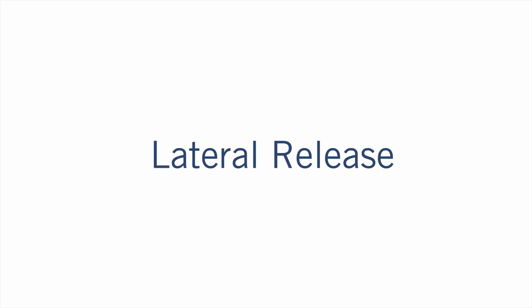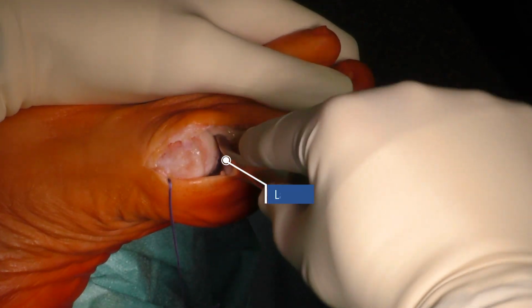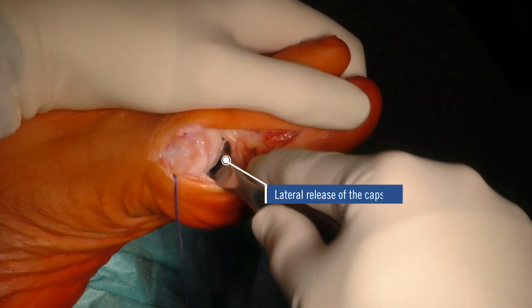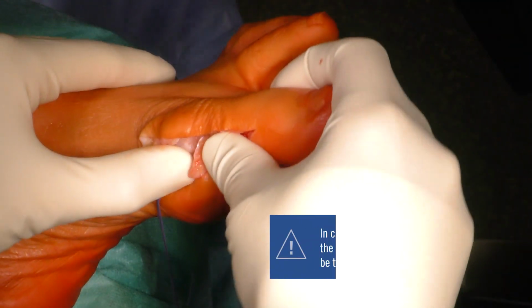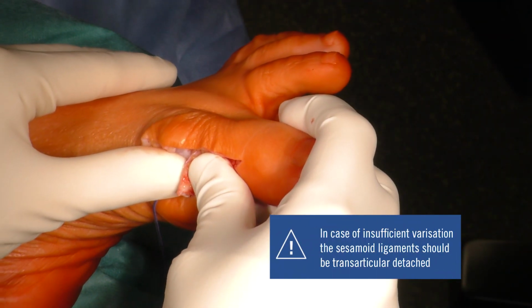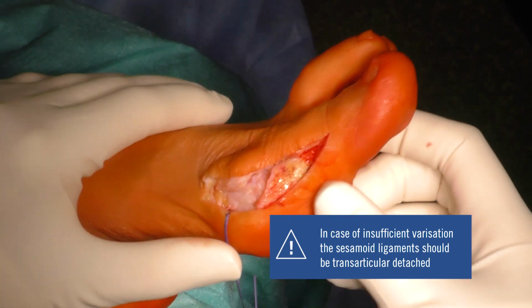Lateral release. In cases with contracted lateral soft tissue, a release of the lateral capsule and lateral ligament is done with a Mcglamry elevator. Sufficient varus should be checked. If necessary, a transarticular release of the lateral metatarsosesamoidal ligament is recommended.